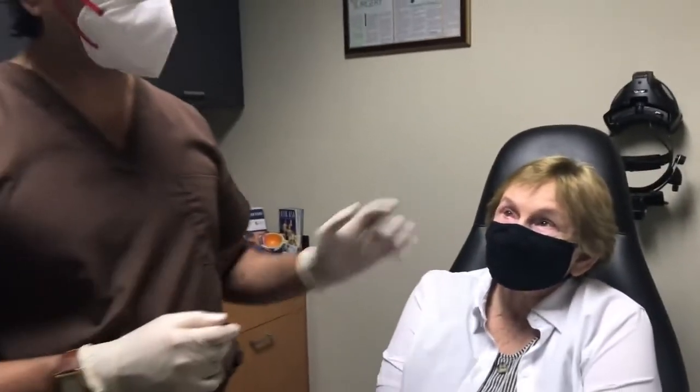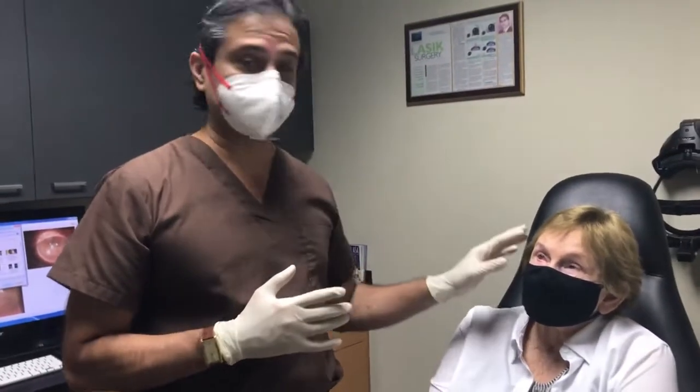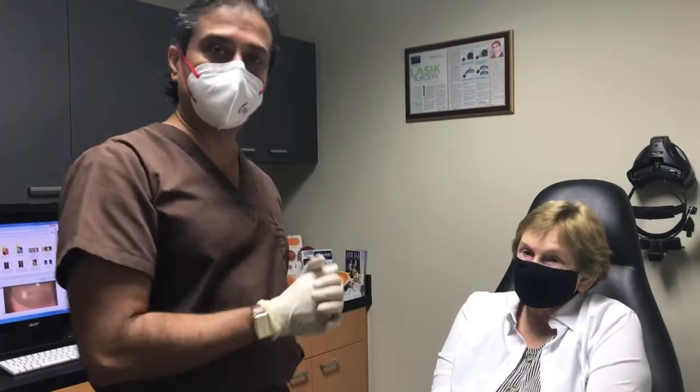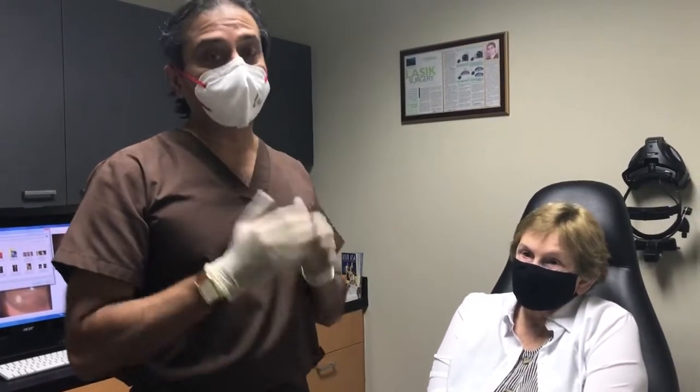She's also had blepharoplasty with her doctors. Now we're trying to heal this cornea. Because she has no sensation following a recent brain surgery, we're trying to see how we can heal this cornea and help her body recover, and prevent a thinner and thinner situation which might even perforate at some point.